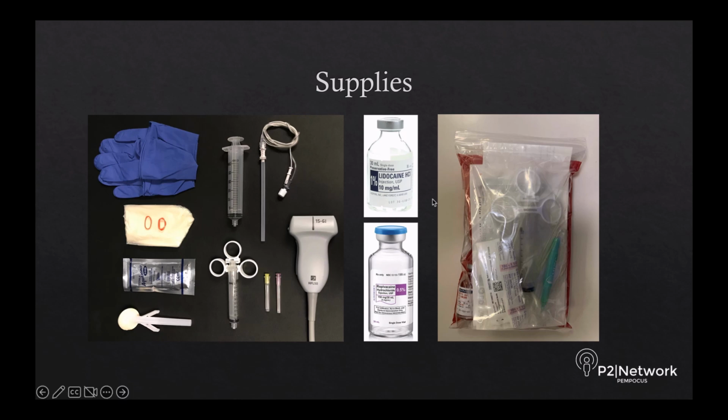Along with these supplies, you need your anesthetic. You can use either a short-acting anesthetic such as lidocaine or a longer-acting anesthetic such as ropivacaine or bupivacaine. That all depends on how long you want your block to last. We typically use lidocaine just to get us through the procedure itself.